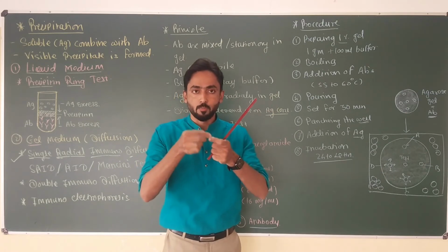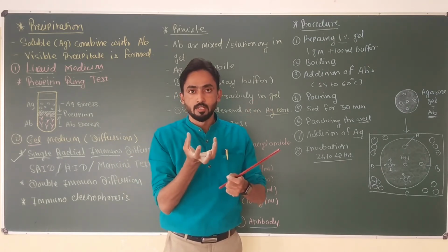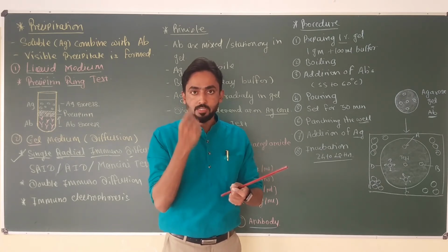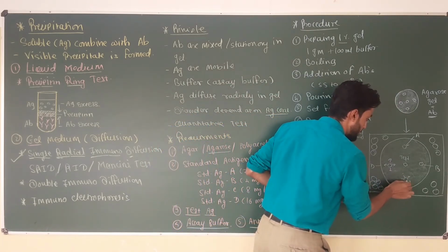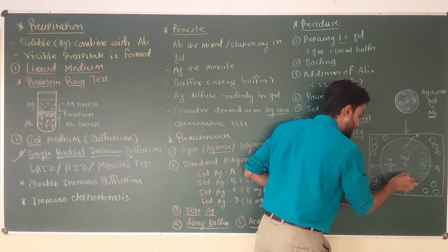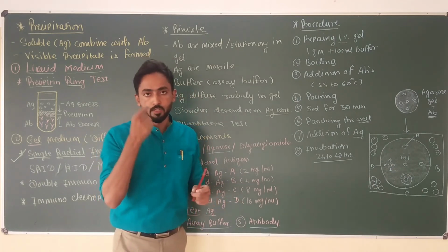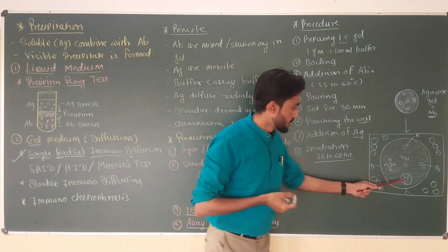Antigen-antibody complex is produced, the zone of equivalence occurs, due to which a lattice is produced, the precipitation complex is produced, and due to which a visible reaction occurs. For example, due to the diffusion of antigen from well C, the line occurs somewhere here. Precipitation is observed as a white line, a white precipitation line around the well.